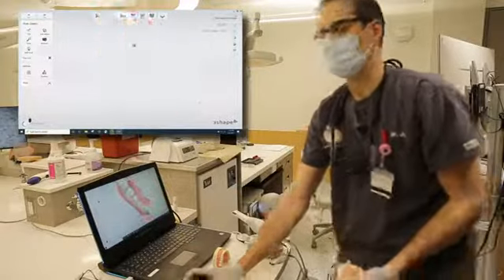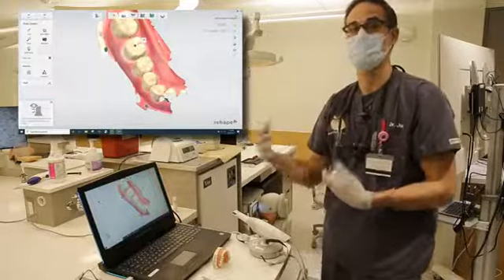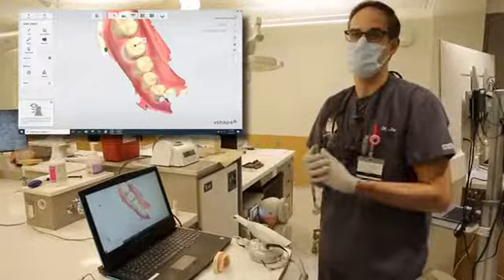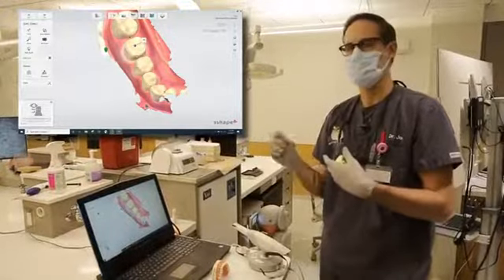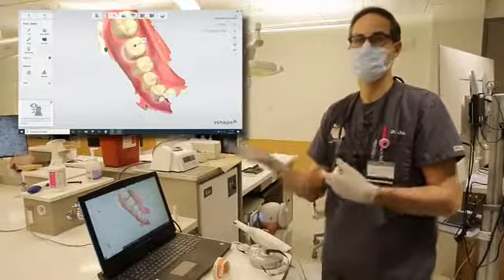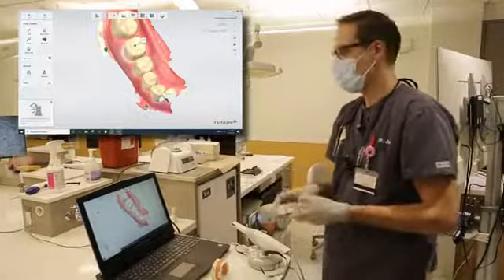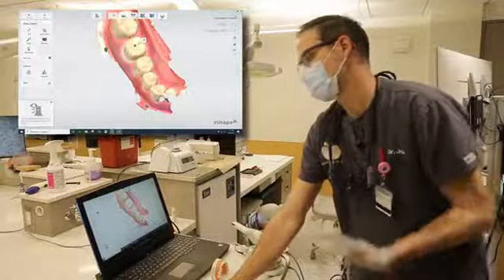It makes it much more convenient for the patient, as opposed to impressions where if we had a small spot in the impression that wasn't perfect, you have to redo the entire impression, which means the patient's sitting with impression material in their mouth for another 5 minutes and then evaluating that one. Very often we try to keep one custom tray, so one tray that's been made for the patient. If we have an impression that just has one tiny defect somewhere that isn't important, we may use another tray to take the impression, and now the lab has to somehow bring those two together to evaluate and make a crown for the patient. So this has been a really nice tool that we have for our patients in order to be able to make crowns for their patient clinically.